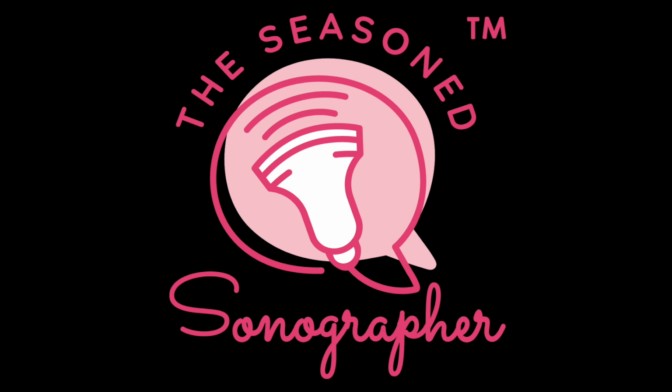It just provides a better, more high quality image, better detail when you're looking at that cardiac activity, the yolk sac, more crisp edges on that crown rump length. That high frequency transvaginal probe is usually 5 to 9 megahertz, and that's just providing great detailed imaging.